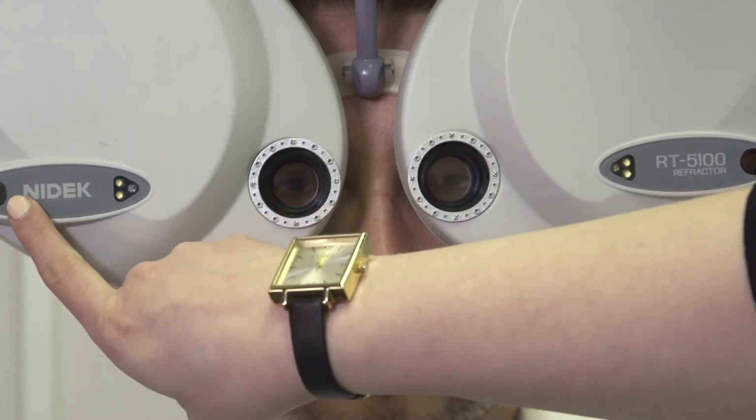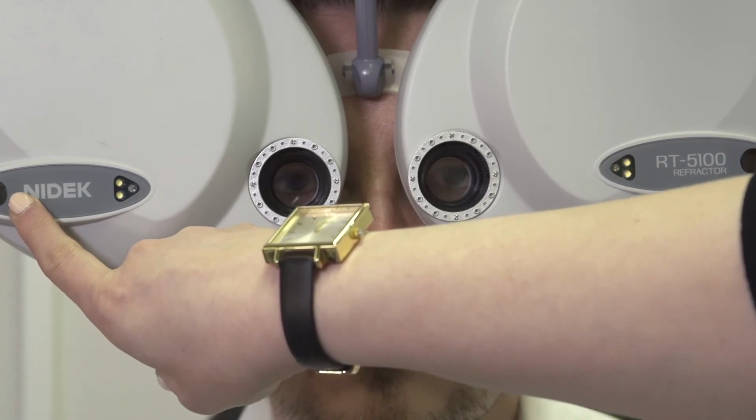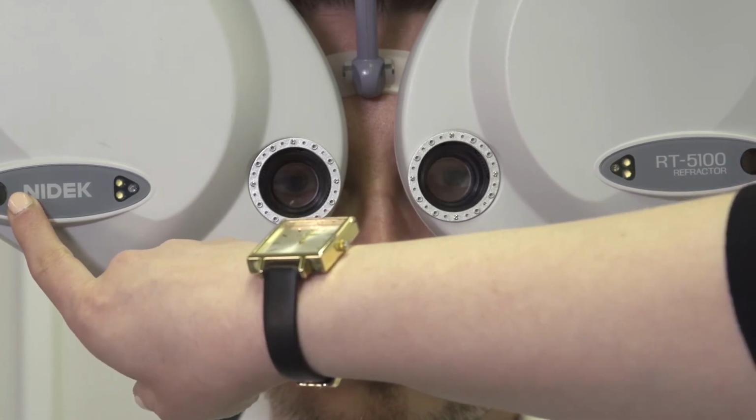Using the viewer just on the side here, we're able to check for back vertex distance, which is automatically set at 12 millimeters.